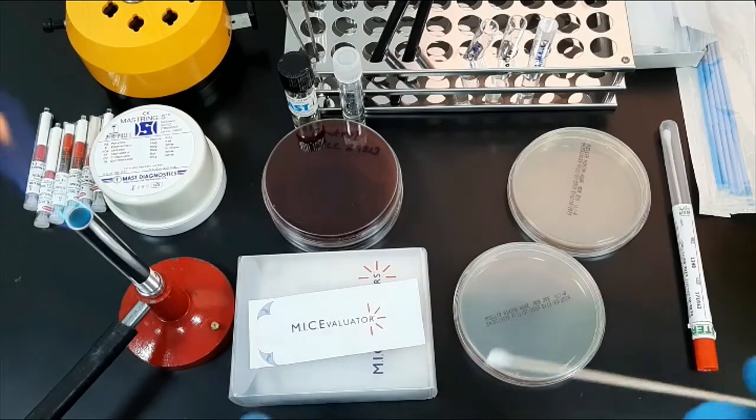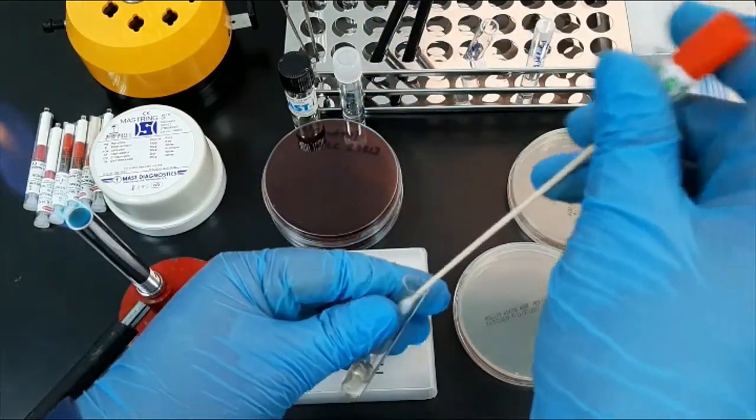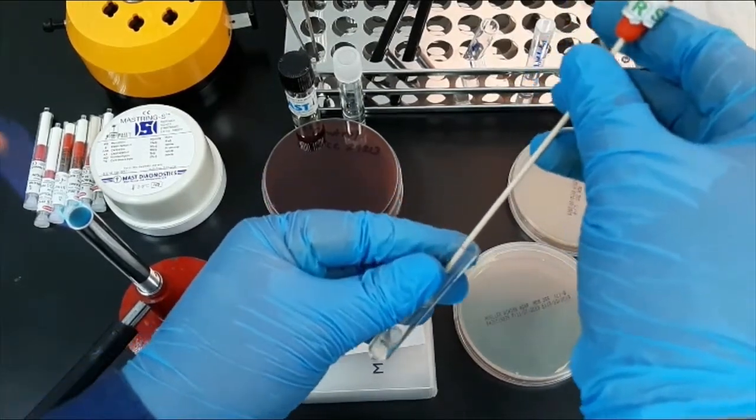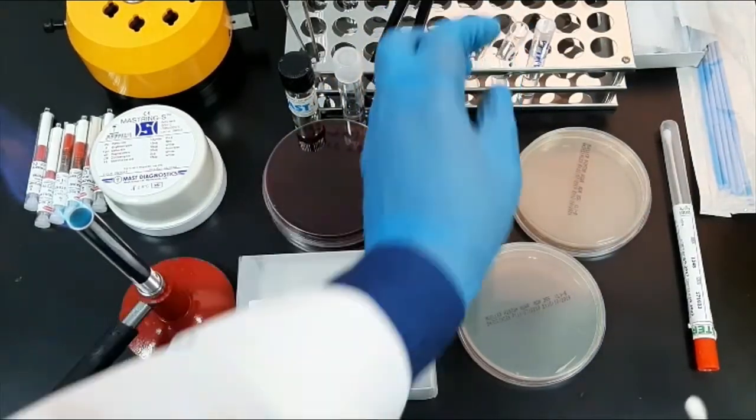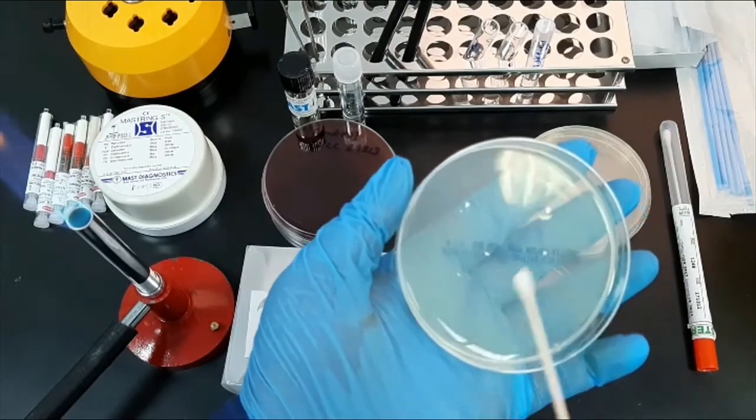Let's start the procedure. Pick up a sterile cotton swab and the bacterial suspension. Dip the swab into the bacterial growth, and when you take it out, remove any excess liquid by pressing the swab against the side wall of the tube. Then open the plate and inoculate the lawn culture.